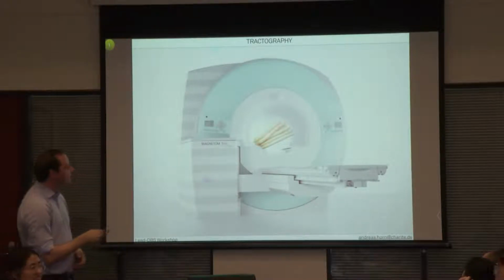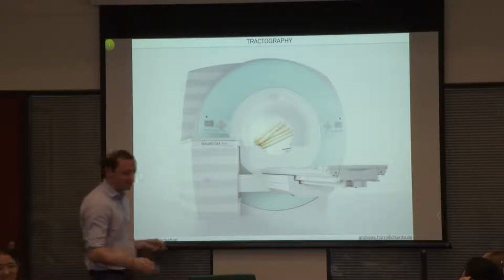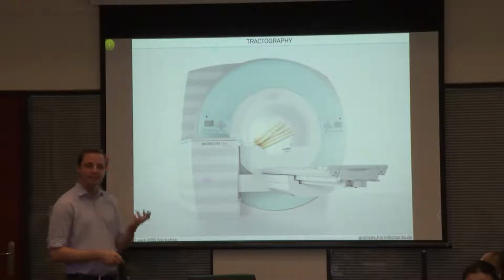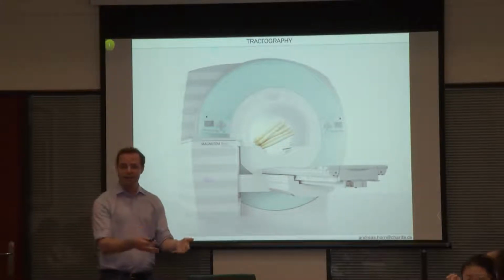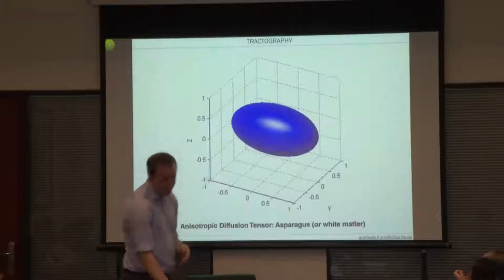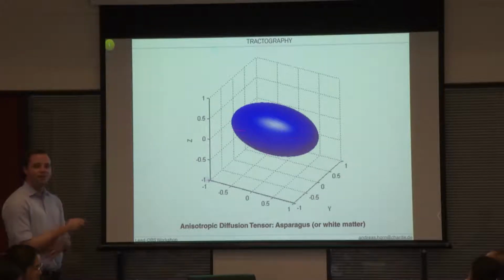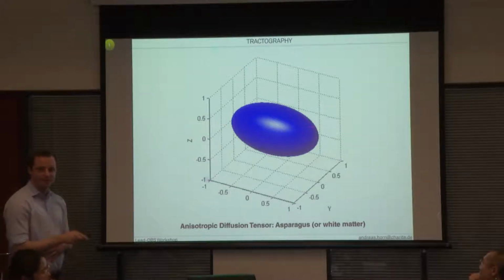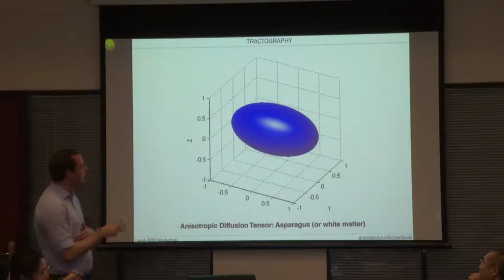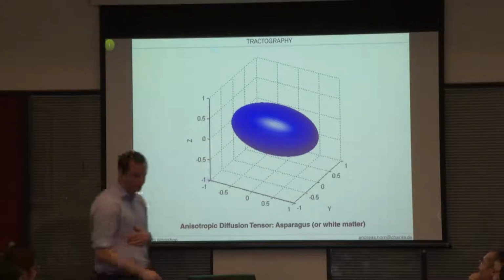They have fibers with water inside, so they have hindered diffusion inside of them. And our MR physicist at the institute where I was before actually did that. So he put asparagus in the scanner a lot to do tractography in the asparagus. And then you would get something like this. So you have more diffusion alongside the tracts, more than in this direction. So you have a stronger probability that the water diffuses this way than this way.